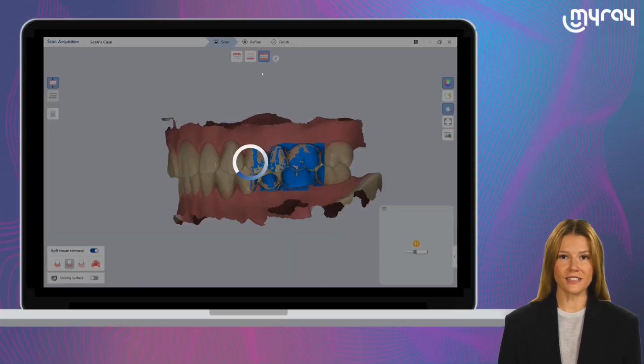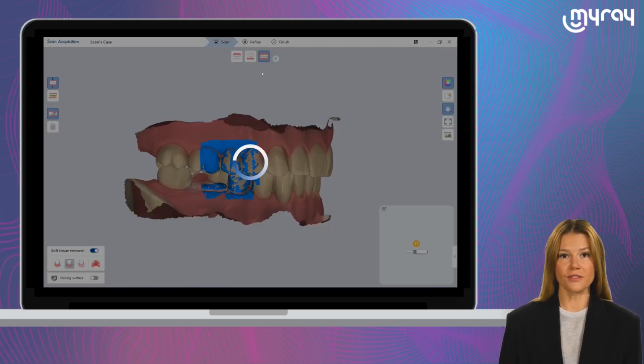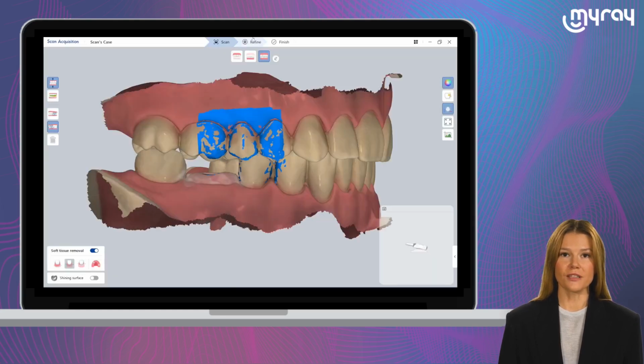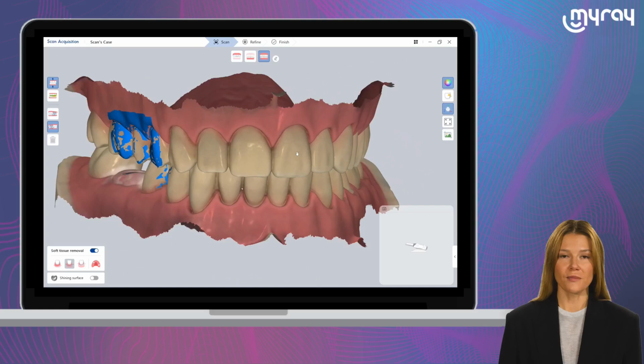The recording of the bite begins by bringing the device to the area between the premolars and molars. We bring the patient into closure and activate the acquisition by moving in a zigzag between the two arches. After a few moments, the bite registration will be completed and it will be possible to carry out the acquisition also on the opposite side.